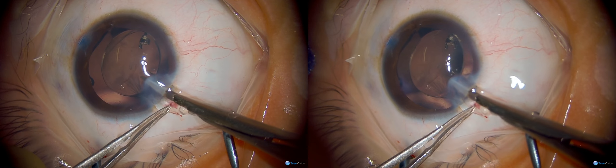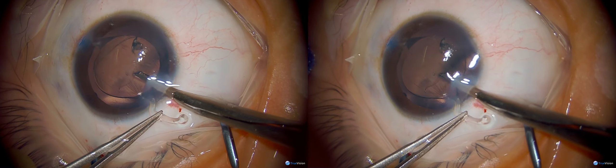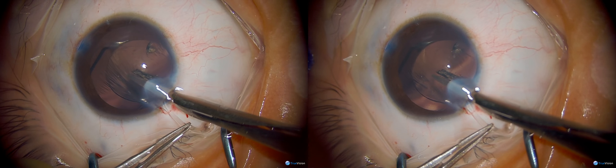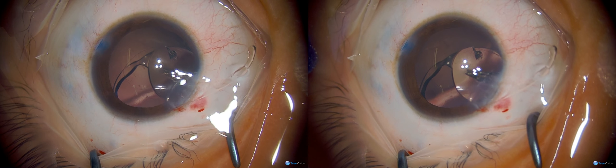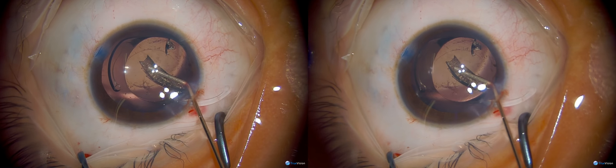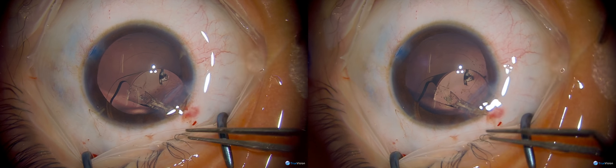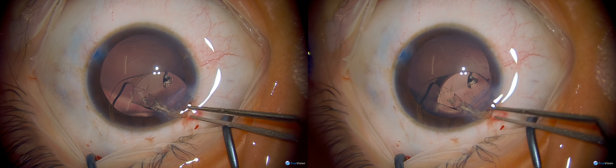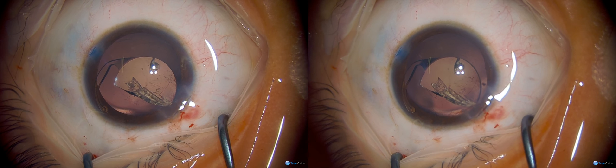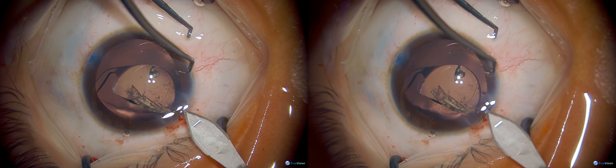This is a good illustration of how explantation is most easily done: grasping that haptic and cutting directly underneath the haptic that is in your forcep while it's outside the wound. These are simple Vannas scissors, cutting across the mid portion of the lens extending from behind one haptic to behind the opposite haptic, giving you two roughly equivalent halves each with a haptic as a handle to guide them out of the incision. If you don't cut underneath the haptic, you have a hard time removing those fragments.